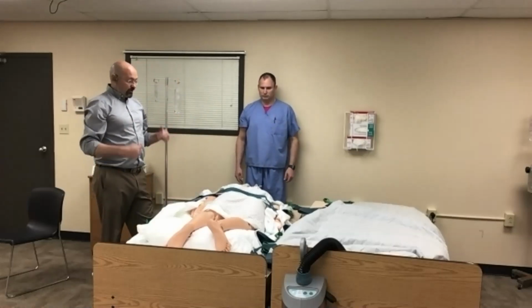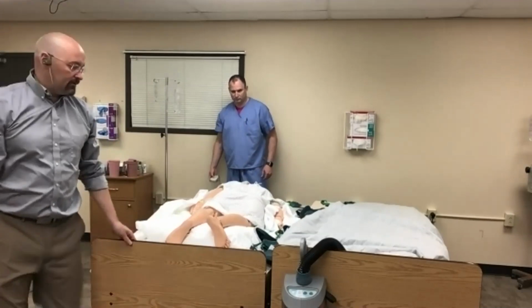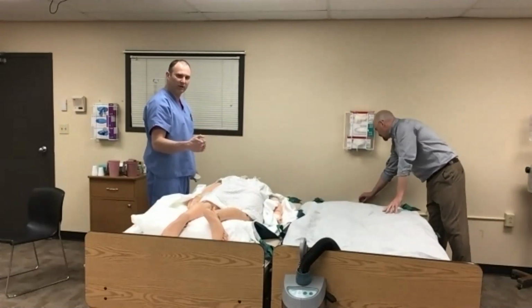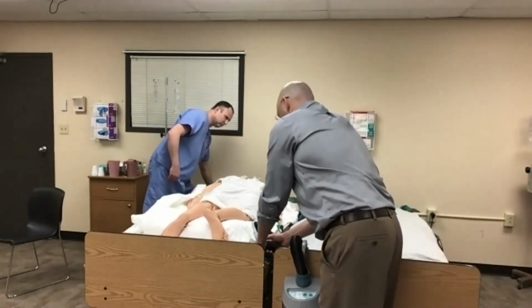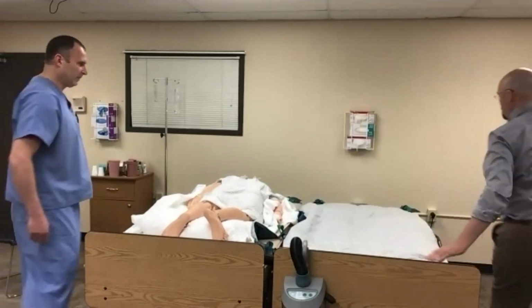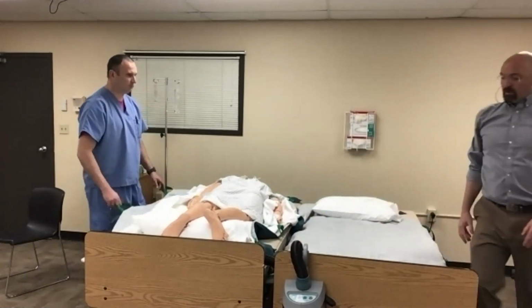What we're going to do now is go through the return process, which is getting him back supine onto our next surface and then back in the bed again. Make sure you disconnect the headboard or the link system from the mattress. And realize that when we proned this guy the first time, the reason we went back is because we didn't slide him laterally enough to get him to the middle of the bed. So we're going to go through the same process again. We're going to inflate the mat. We're going to bring him across to where his body is going to start to tilt. And we would have this dressed with the sheet and chuck pad as well. And when you're ready? Ready?